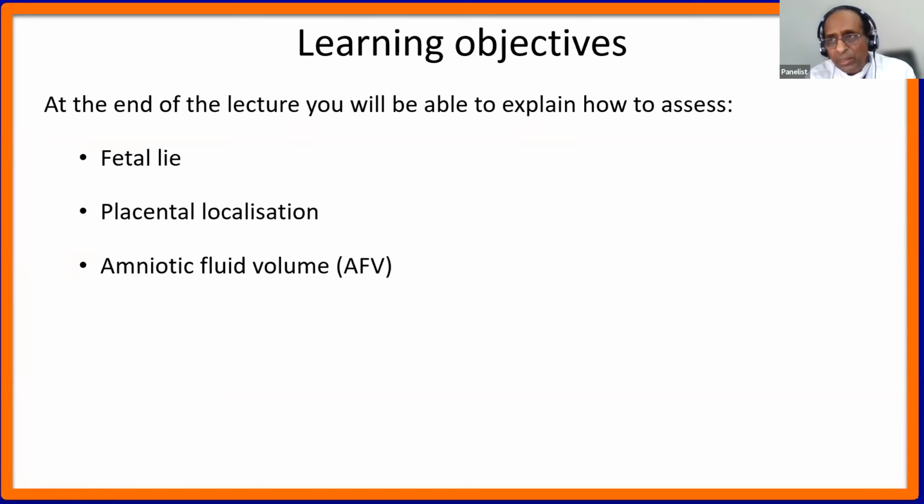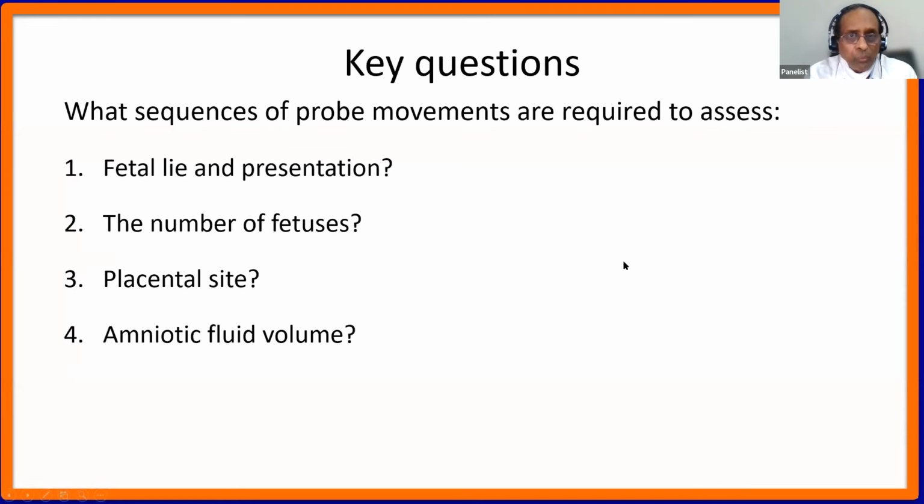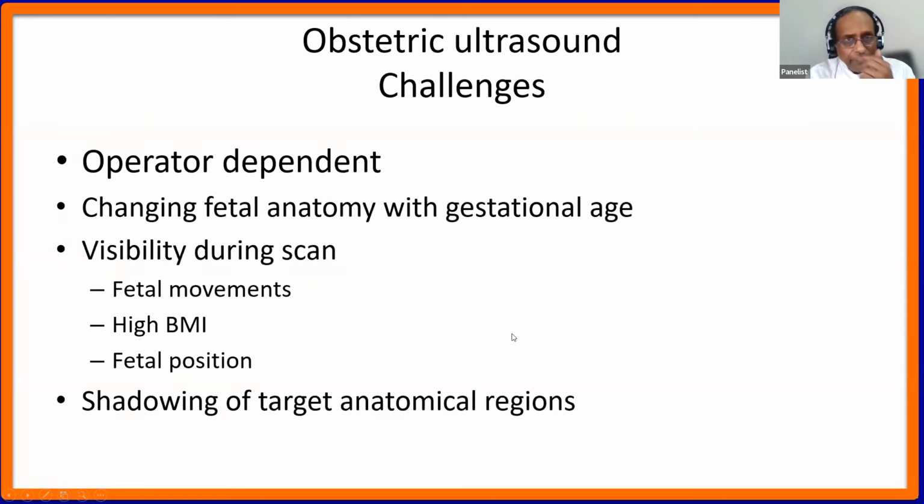This is all that, and also fetal biometry, basic biometric measurements are done here. So what we would like to know is, how do you move your probe? What probe sequences you need to use to identify fetal lie and presentation, the number of fetuses, placental site and amniotic fluid volume, and also how to do the basic biometry.